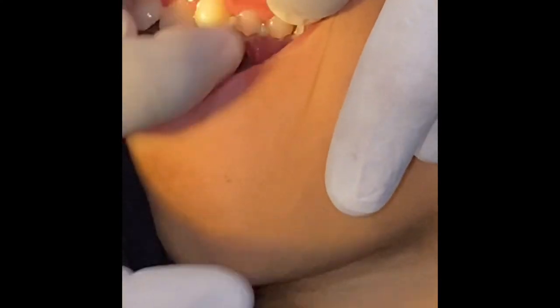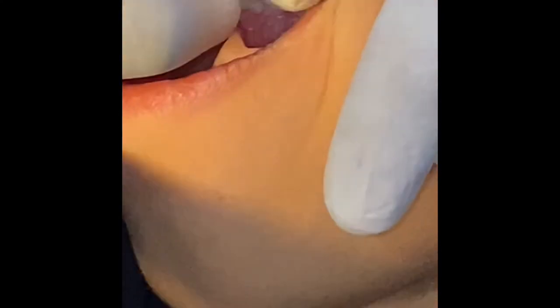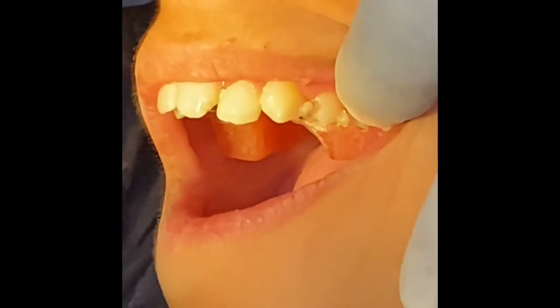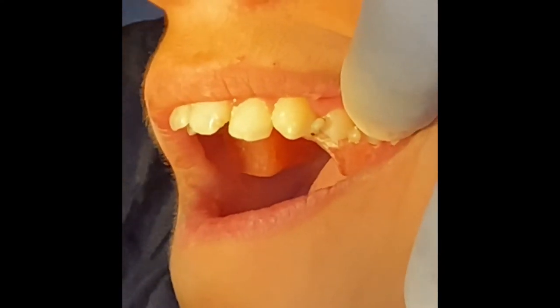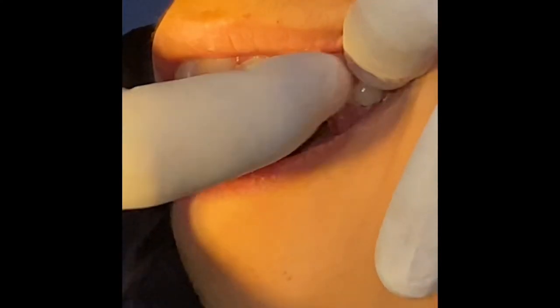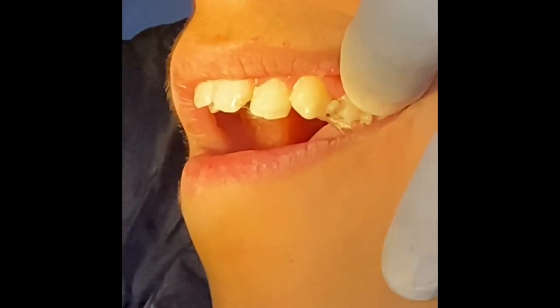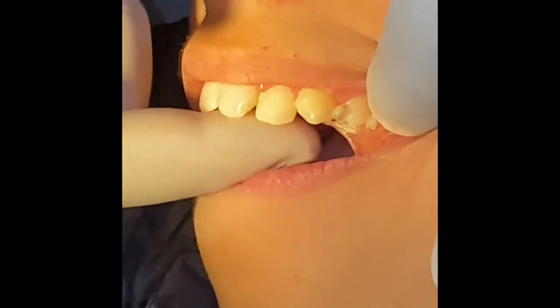Now you can see the ends are not pinching. But the issue is that you won't be able to tighten it further once you have attained full retention. If you need to move the clasp a little bit down, you will have to put the composite on again.